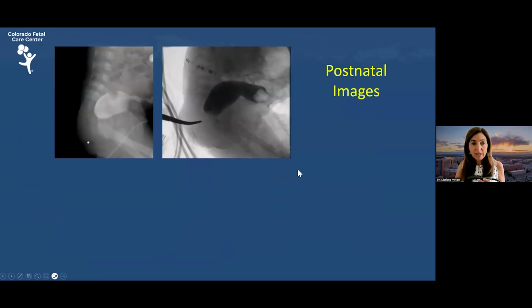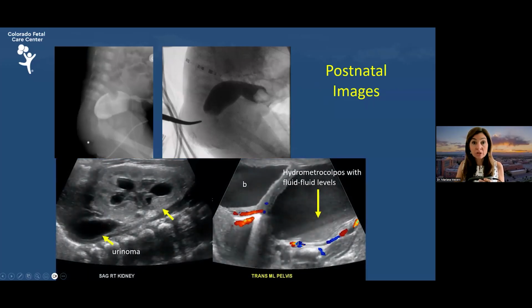The patient had a colostomy in the first 24 hours of life, and then afterwards we do a high-pressure colostogram. So we do this in fluoroscopy or in the IR suite, and we inject contrast at high pressure, although this is hand injected, to fill the distal rectum. And then we put a BB marker or a clamp or some sort of instrument that tells us where the perineum is, where the anal dimple is, to figure out what is the length between the distalmost aspect of the rectum seen and the perineal opening, because that helps the surgeons identify how they're going to do the surgical approach.